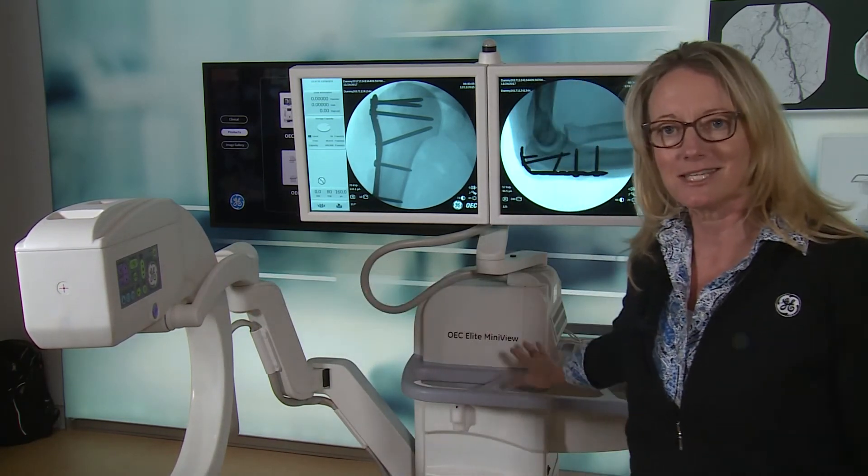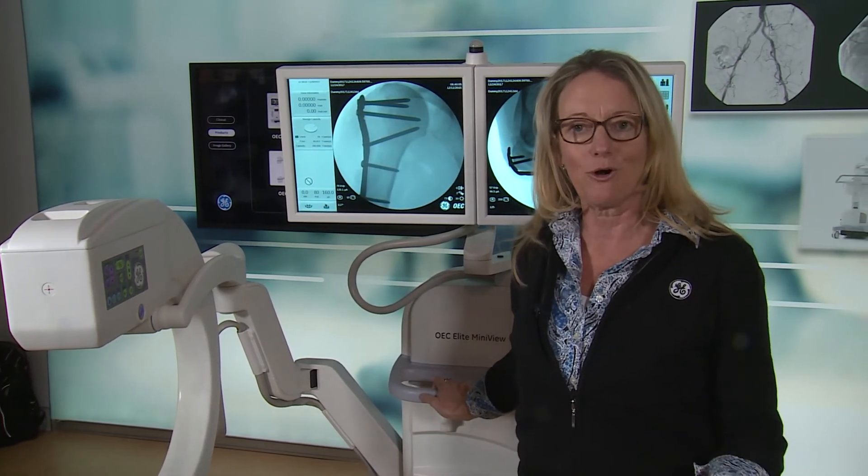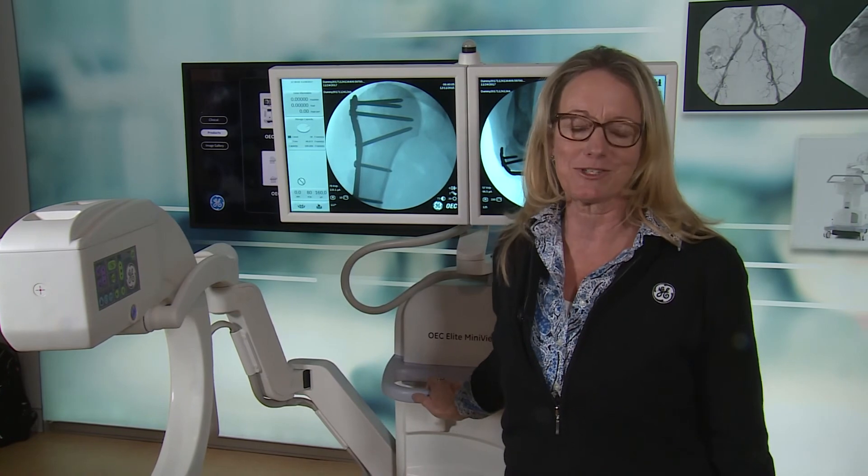We hope you find that this C-arm helps to bring extremity surgery with more control and flexibility for your customers.